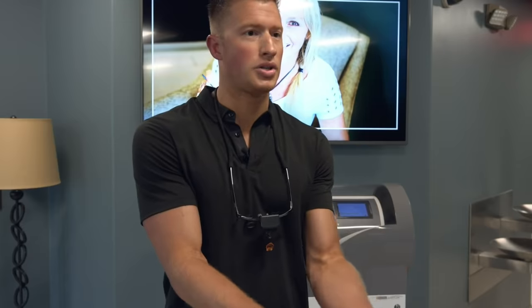The other thing would be, typically most surgeons are oral surgeons, periodontists. And there's a lot, by the way, that use guided implants. I don't know if there's any in our area, but I don't want to say that there's not. And I'm not saying you can't get a quality implant placed by an oral surgeon or periodontist doing it freehand. That's not the point of this. The point is making an argument that I think it's a lot easier to deliver quality dentistry with a 3D guide, and there's a ton of benefits to the practitioner and the patient for long-term health and even the process itself. So that's really the argument I'm making. But as far as the cost, you're typically going to pay just the surgeon for the fixture, which is just the titanium root.